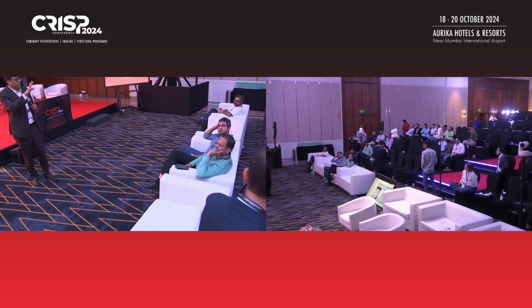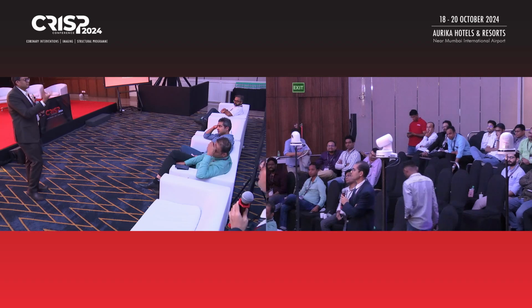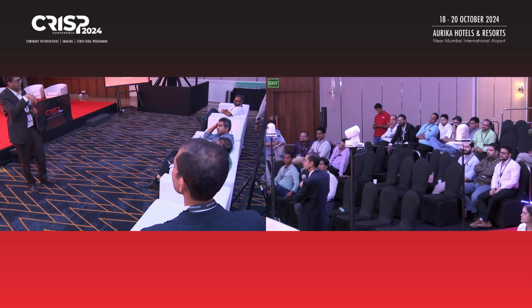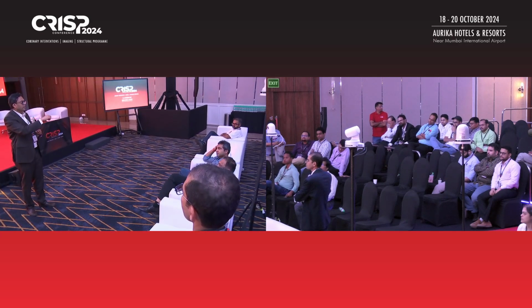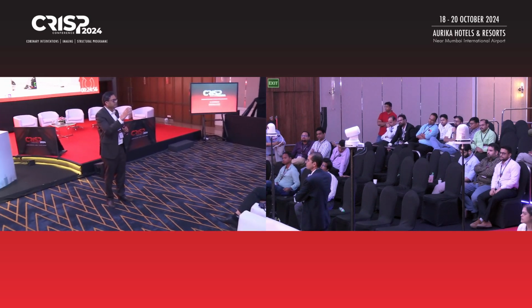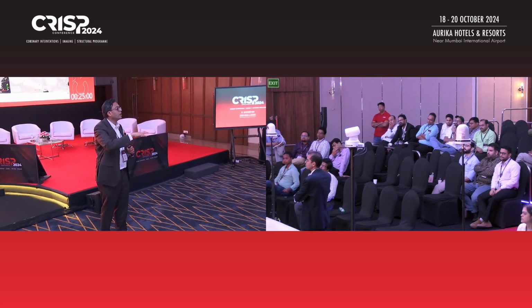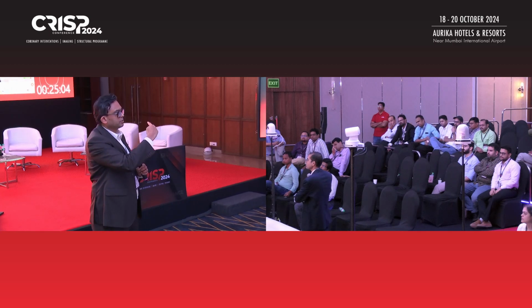So let me say a few things before Arvind starts in. There are a few things. So calcium, which Chirag told today, calcium can be at various places on the wall. Okay, so everything has a different meaning. Calcium at the annulus: annular rupture, paravalvular leaks. Calcium at the raphe: inappropriate expansion. Calcium at the belly: good, will hold your valve. Calcium at the tips: coronary obstruction.